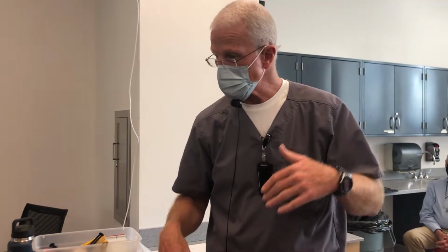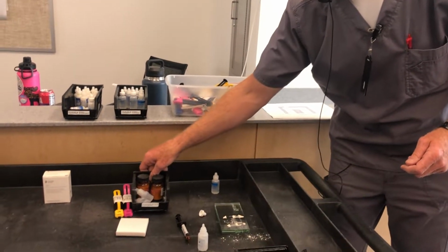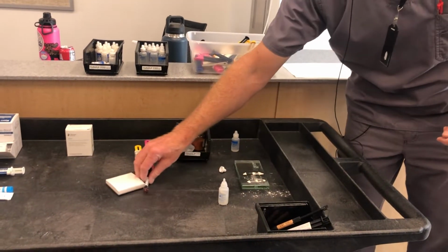And so, in a way, we had to be a little bit more exacting in those days because our cement materials were not quite up to a point where they are today. Now that doesn't give us a license to get sloppy with margins, but that is a factor. As we go toward the resin cements, they're less soluble. That's another thing. Let's put this over here. This is polycarboxylate.